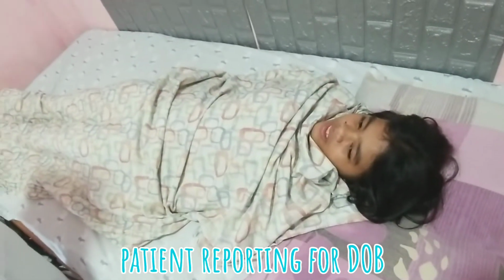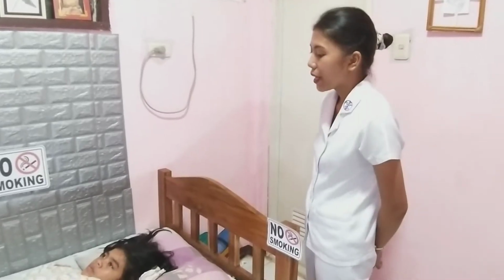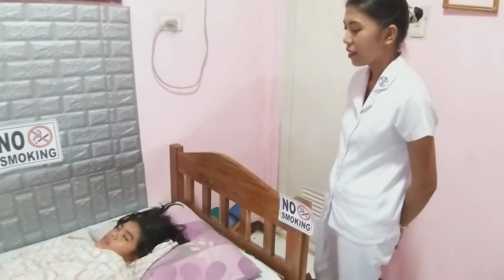Hi ma'am, I am your student nurse for today. How are you feeling right now, ma'am? Naglisod gyapon kog hawa. So next is we are going to prepare the client as well as the supporting system or people. We will assist the client into a semi-Fowler's position if possible, because this position facilitates optimal lung expansion. Ma'am, i-adjust na to imong bed ha.